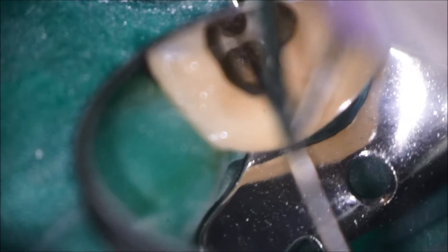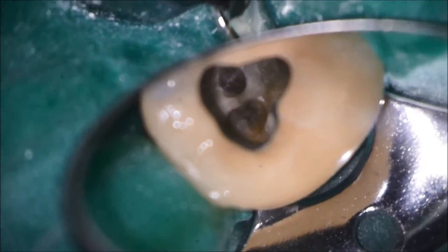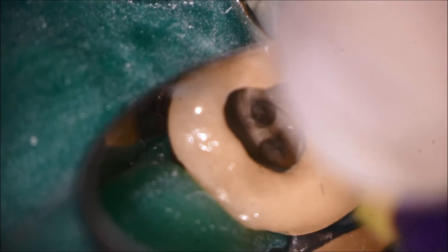Once you've worked the micro-opener a millimeter or two into the canal, then you're ready to begin with your files. A small number eight or number ten hand file is used to work down the canal with a watch-winding motion. The hand file will create a path for all engine-driven files to follow.